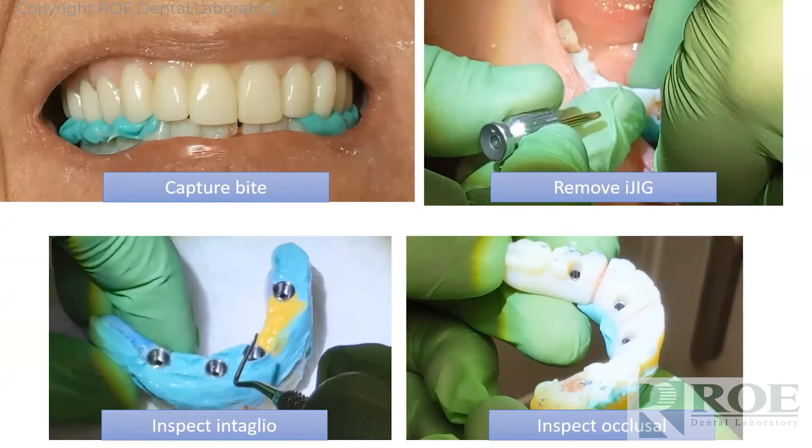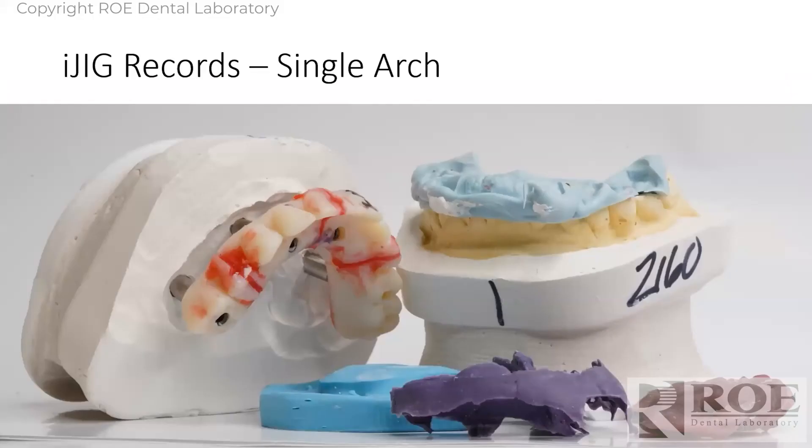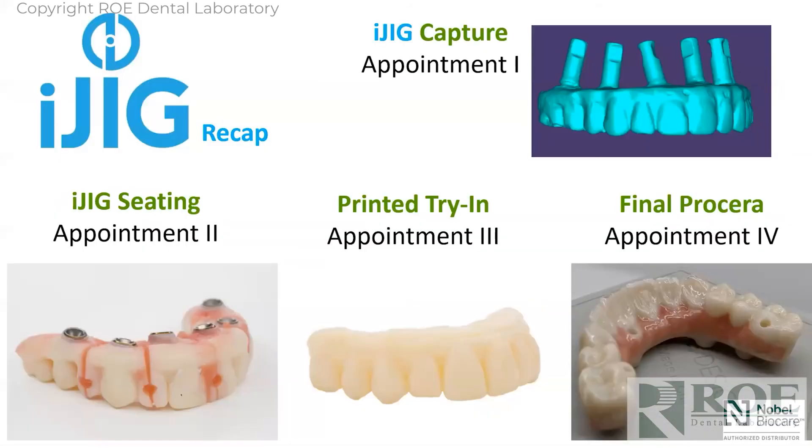Then send it off to us, and this is what we receive. Looking at the screen you might think 'what a mess,' but what we have is teeth, tooth position, implant position, bite registration, opposing, and a reline impression — so now we have an adequate, perfect soft tissue model. From that, we make a printed try-in and go to final, or go directly to final since the iJig was really a prototype — totally up to you.